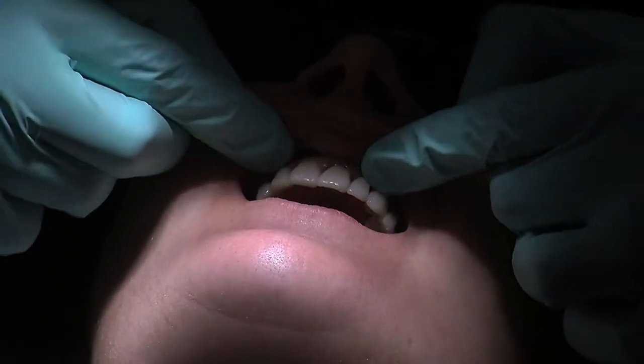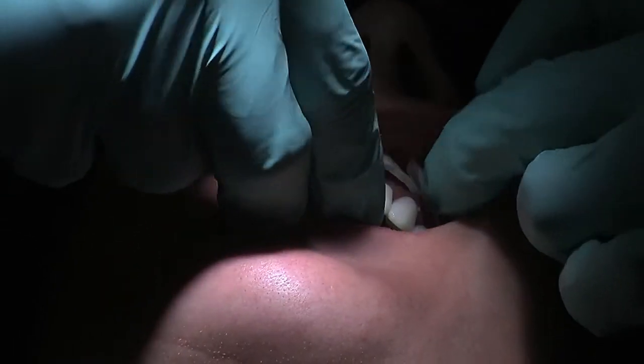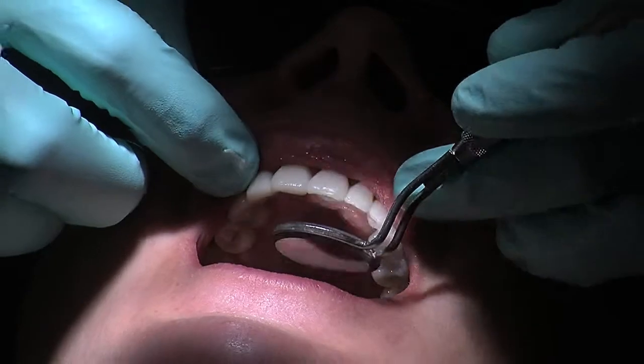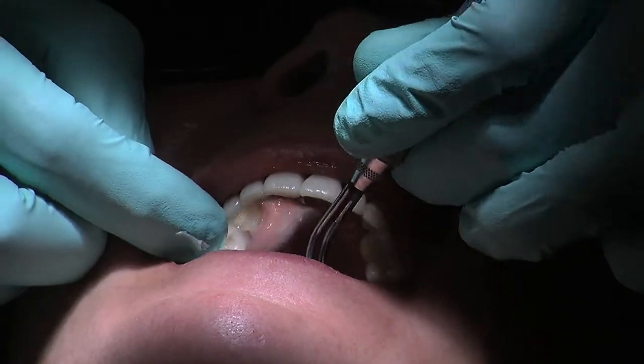And lo and behold, all beautiful white teeth in one go. You can see there's a very thin flash. All the excess has come out, which is always a very good sign that the putty index was made properly. And there's almost no flash palatally, so did a good job there.